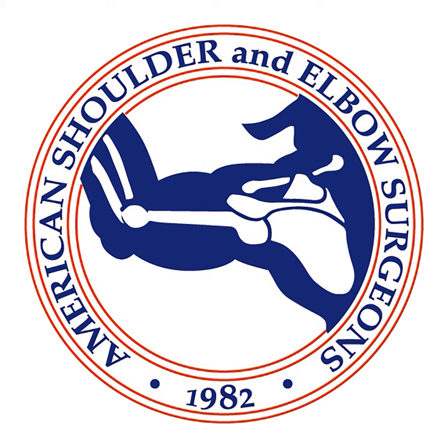So, Dr. Sperling, do you have some primaries that are still cemented, and if so, who is that patient? Actually, in my practice, the answer is really none. I haven't cemented a stem on a primary probably in 15 years. What I will tell you that we've learned with stems, and we learned from our hip and knee colleagues here at Mayo, the only time I cement now is I do a cement within cement technique on my revisions. So what we'll do is take a 122 stem that's cemented in there, and I'll cement in an 83 millimeter stem, a more narrow, shorter stem.